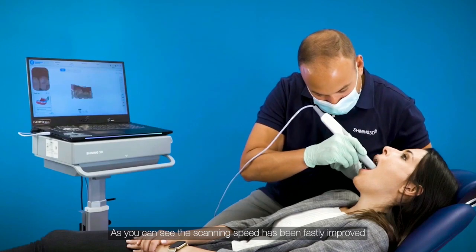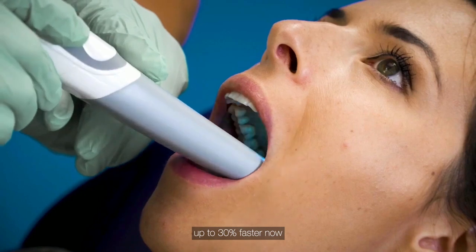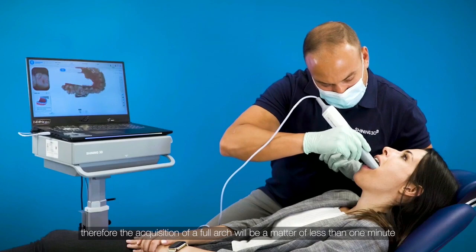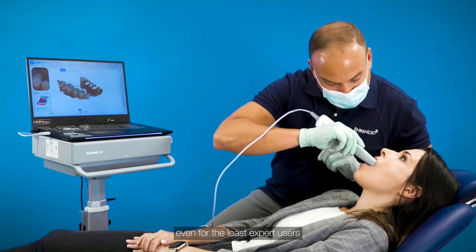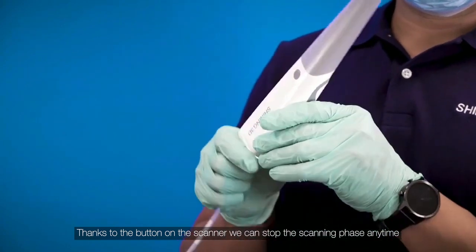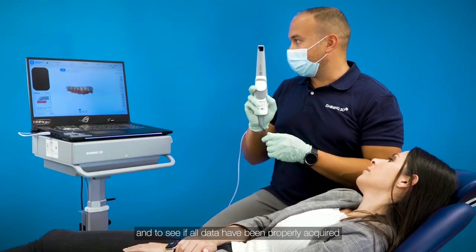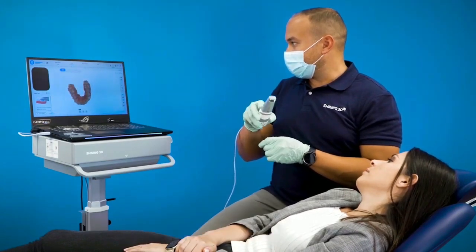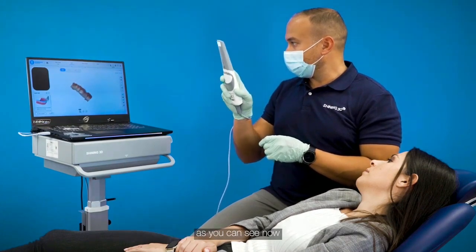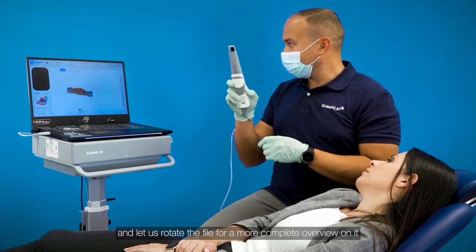As you can see, the scanning speed has been drastically improved, up to 30% faster now. Therefore, the acquisition of a full arch will be a matter of less than 1 minute, even for the least expert users. Thanks to the button on the scanner, we can stop the scanning phase anytime, to check the quality of the acquisition and to see if all data have been properly acquired. The same button will let us activate the motion control tool, as you can see now, and let us rotate the file for a more complete overview on it.